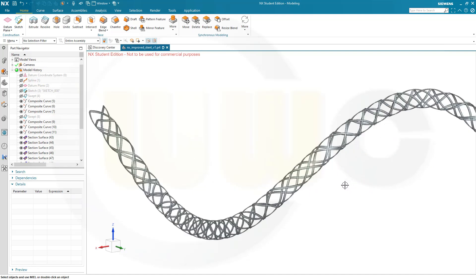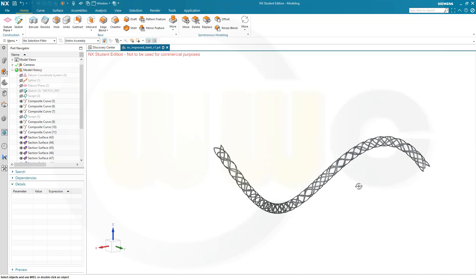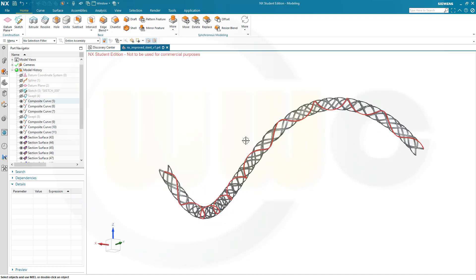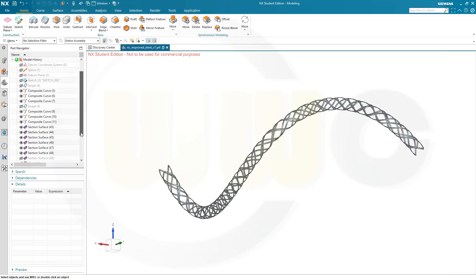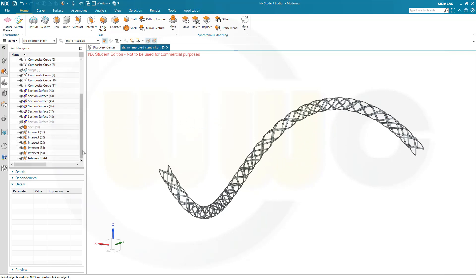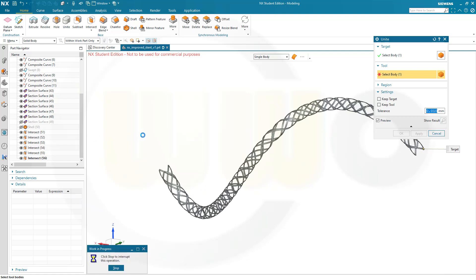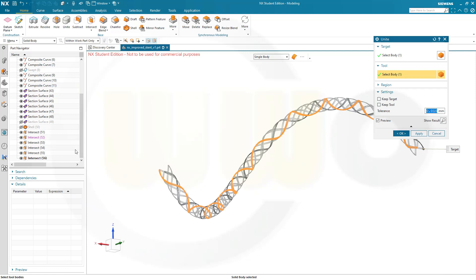And now in order to unite, it will take a little while, so I will start and then stop the recording and start it again when it's finished. So go for Unite, and select the first one, select the second one. It will take a while and it will take longer with every step. So I will stop right here and then start the recording once it's done.